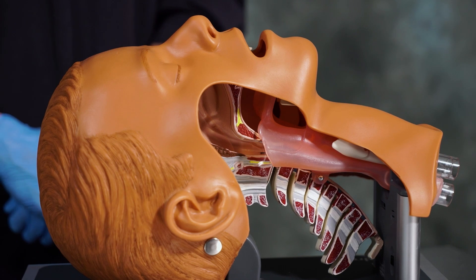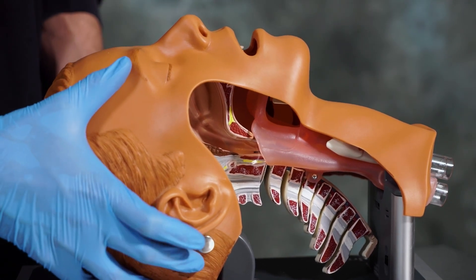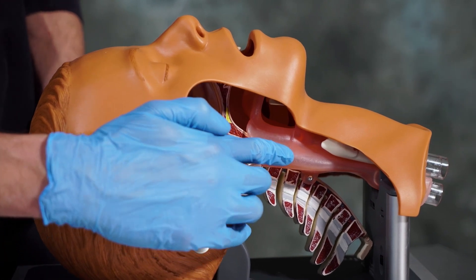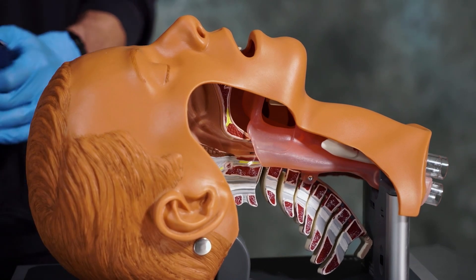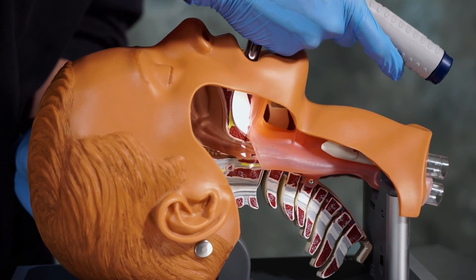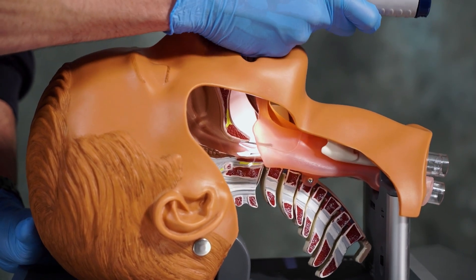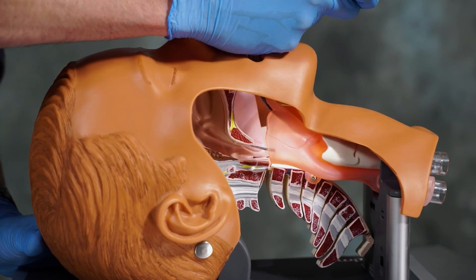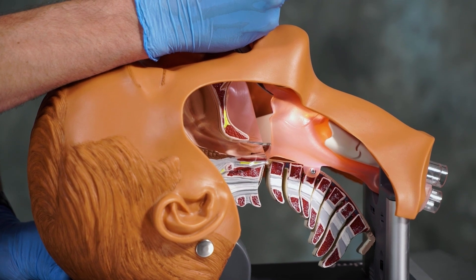This mannequin will provide a better view anatomically for blade insertion. As we can see here in the orange, we have our epiglottis and the vallecula behind that, as well as our vocal cords down below. We'll start with the Macintosh blade. As we insert the Macintosh blade, note that we don't go very far down, just enough to visualize the epiglottis. Once we have the epiglottis visualized, we advance a little bit more into the vallecula and then lift upwards, visualizing the vocal cords.